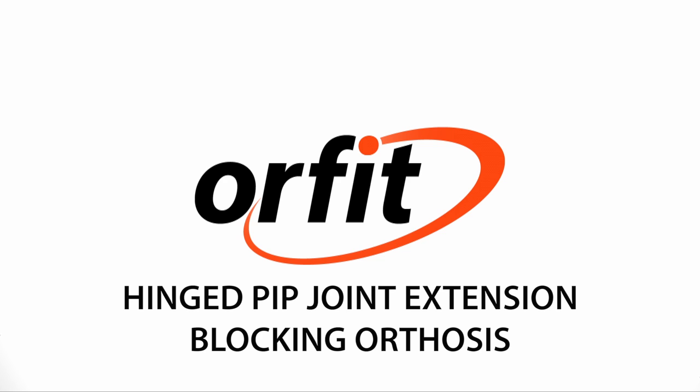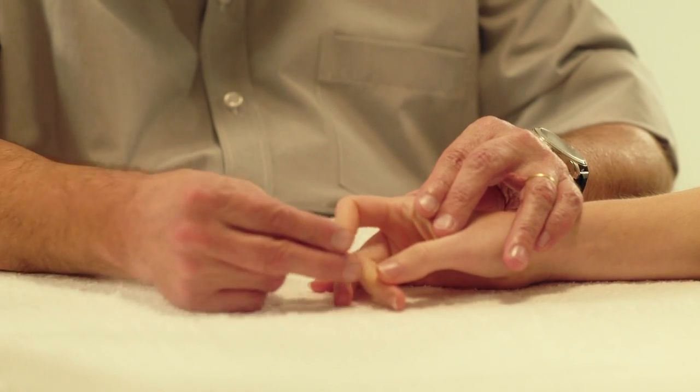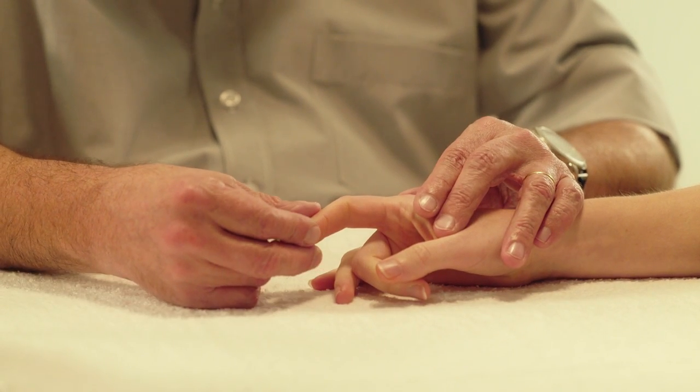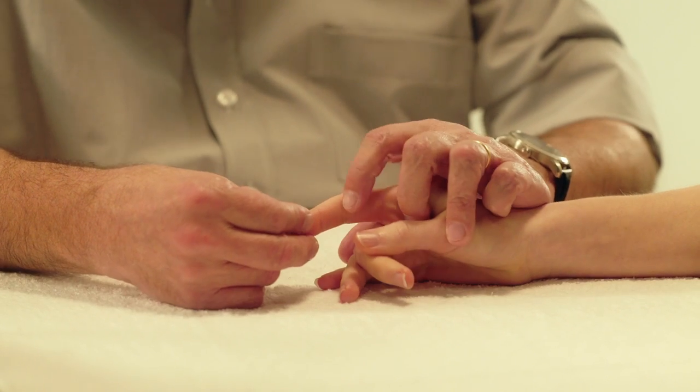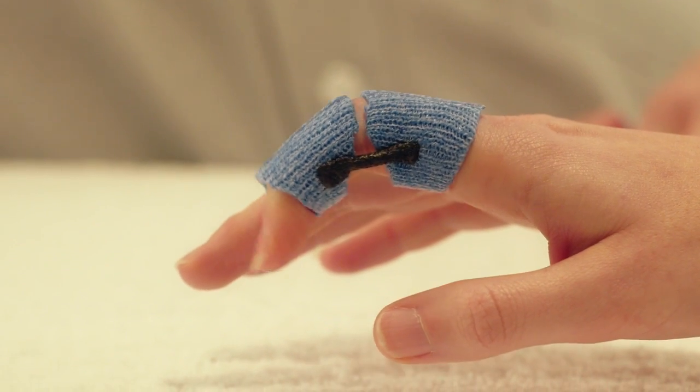Hinged PIP joint extension blocking orthosis. Here we will demonstrate how to make a hinged orthosis which will allow full flexion of the PIP joint but will block full PIP joint extension.